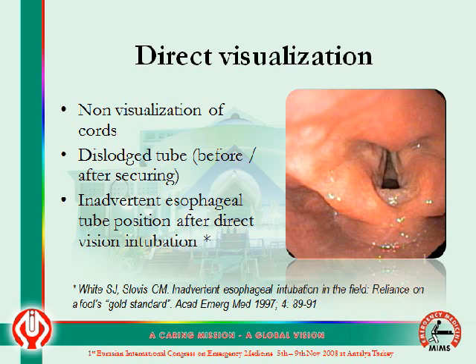Among the different methods, all are useful to confirm the tube position to a great extent. But all these methods are not totally free from problems. Every method has its own merits and demerits. The direct visualization method is supposed to be one of the best and most reliable ones, but it is also not free from troubles.